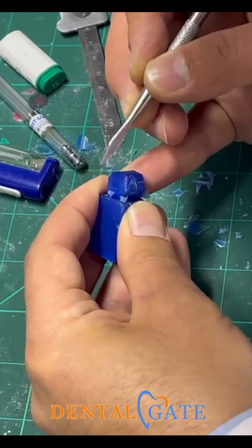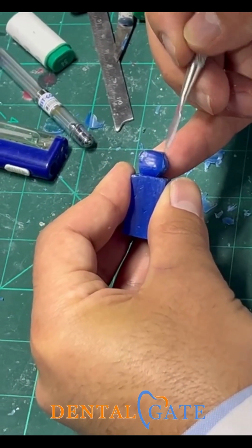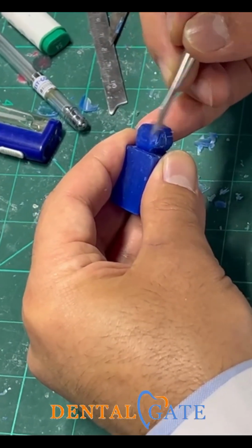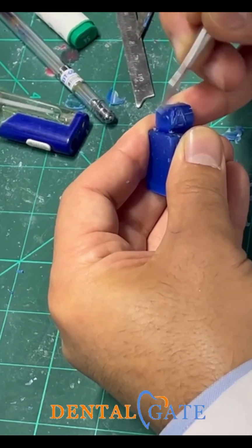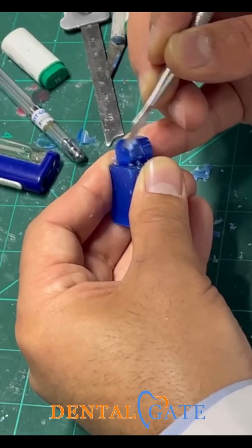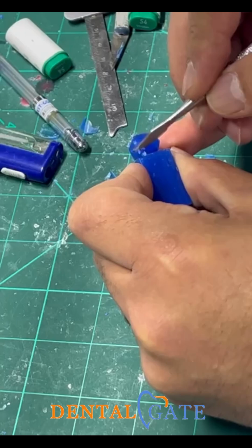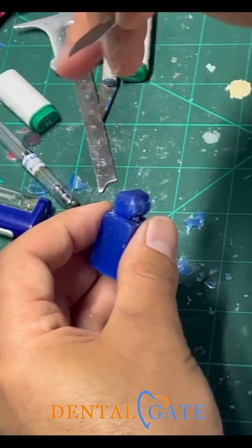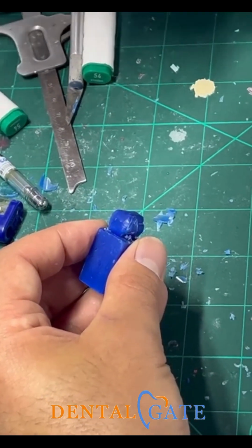So you can see when I make the curvature here, the roundation of the lateral, the distal and mesial, will be produced easily. So when I make a roundation here, not roundation, I will make a tapering in the curve toward the central, toward the top of the block. You can see the contact area will be produced. You can see this is a contact area here. So you can enlarge the shape to 1.5 to avoid the mistake, okay? You can make it.